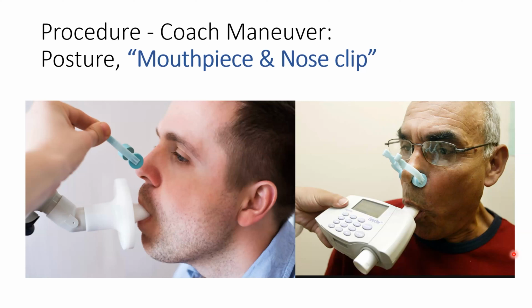Position of the mouthpiece and nose clip need to be very carefully done to avoid leaks. Patients that are unable to use a mouthpiece may be able to use a face mask. In some circumstances, such as patients with trachs or nasal resections, non-invasive adjustments such as sealing the face mask, a variety of tubing connections or occlusion valves can be applied at the discretion of the operator and must be in the operator notes.